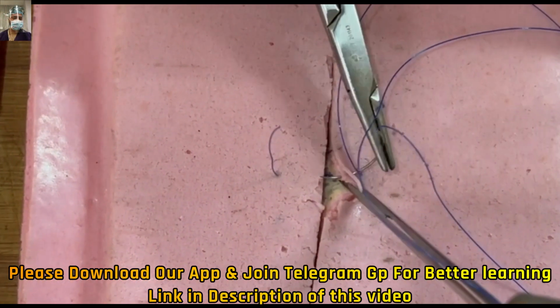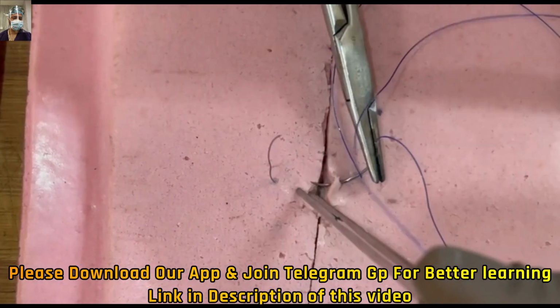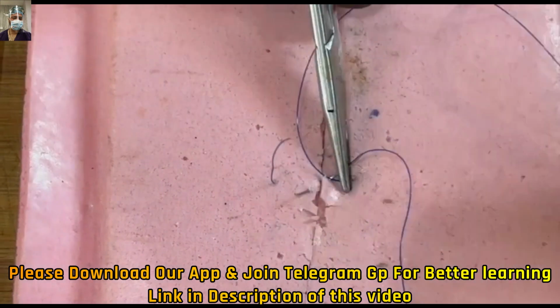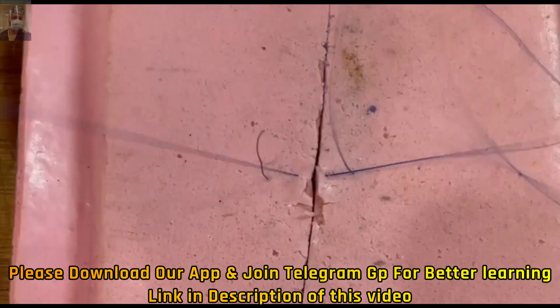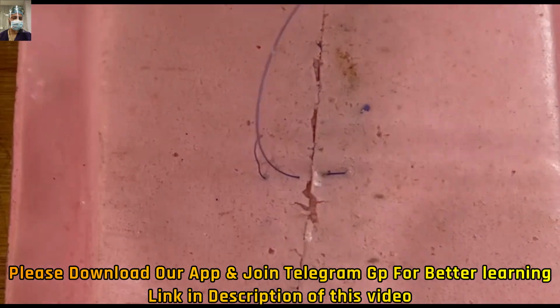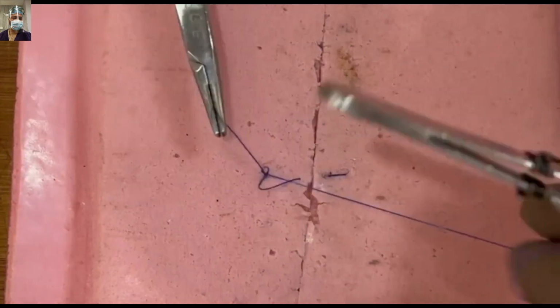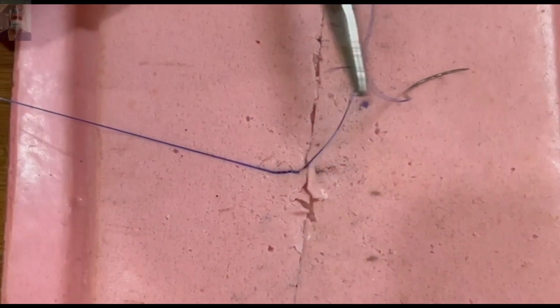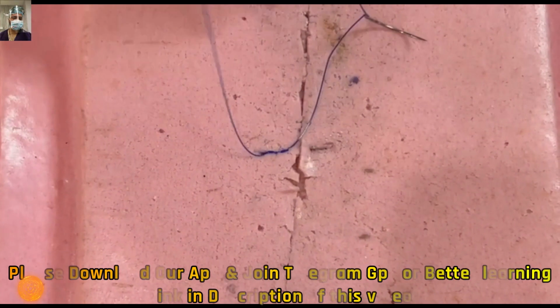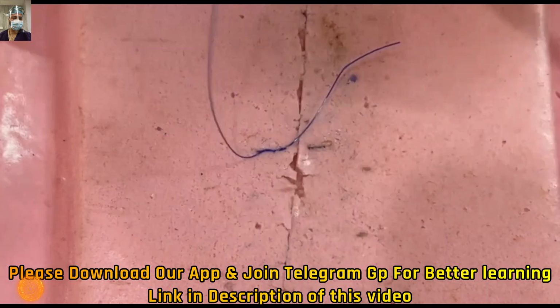When we are taking the near suture, the trick of the trade here will be: don't take more than 2-3 mm of the edge. Just take epidermis and dermis, just 2 mm or 3 mm, not more than 3. 2 mm or lesser is better. That will give you better tissue eversion and the best apposition of the tissue. The more tissue you take, the lesser the apposition, and it will compromise the cosmesis also.